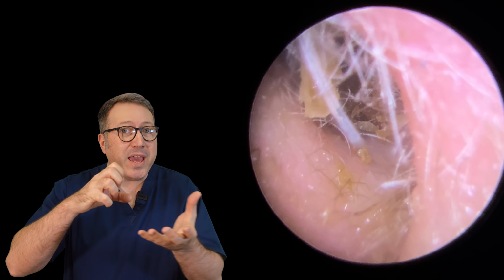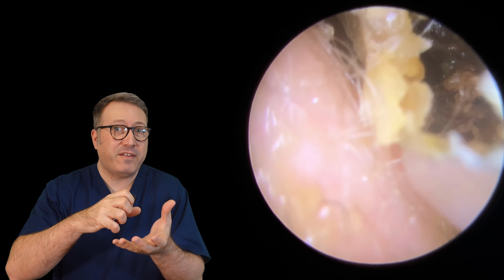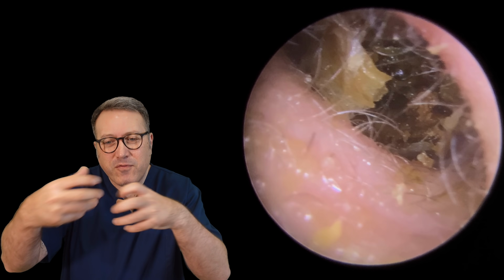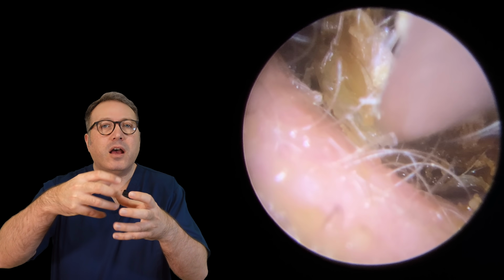And you can see that big chunk of skin there detaching from the left side canal wall. Trying to hold on, but it just kind of unravels the skin rather than draws it out.